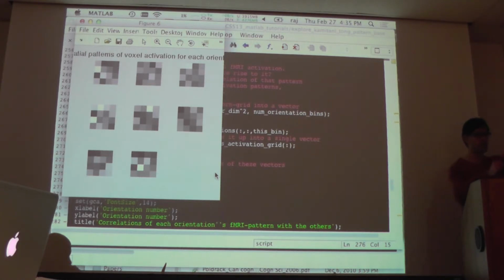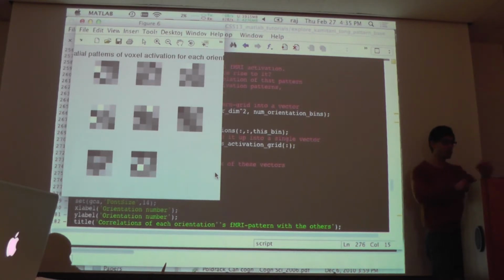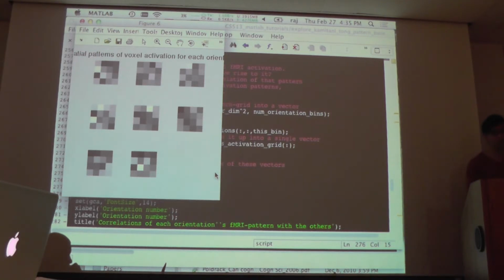Yeah, that's a very, very good point. That's a midway solution, but it's still ignoring the spatial relationships within each individual searchlight. And then there's a different flavor of searchlight where you do searchlights on the surface of the brain instead of treating the brain as a 3D thing. There's all kinds of different approaches, and the answer to which one's the best is nobody knows yet. People are still trying to figure this stuff out. This is all quite fresh and new.